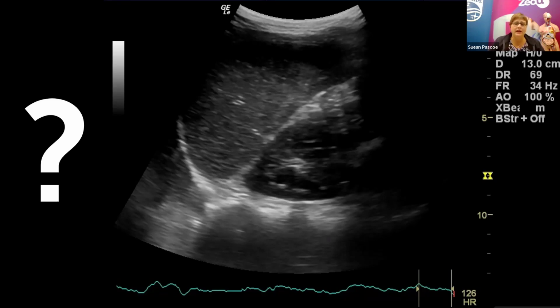So by having a clear idea at the beginning, what question is it that you are asking, and what did you expect the answer to be based on your clinical judgment, you're keeping the focus on a point of care examination with binary questions. I've always spoken about a point of care study: if it doesn't have a yes or no answer, it's not a point of care study. You should be sending it for a formal exam. About the only exception to that is how many weeks in first trimester pregnancy, and that's for obs and gynae more than point of care studies anyway.